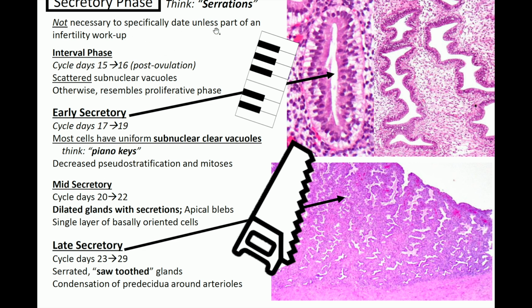So you don't have to be precise in how you sign these out on the endometrial biopsy for every case, saying day 15, day 19, etc. I know personally I would have to practice a lot more to be that precise with dating, but there are patterns that can help you pick up on what day or aspect of the cycle you might be in.